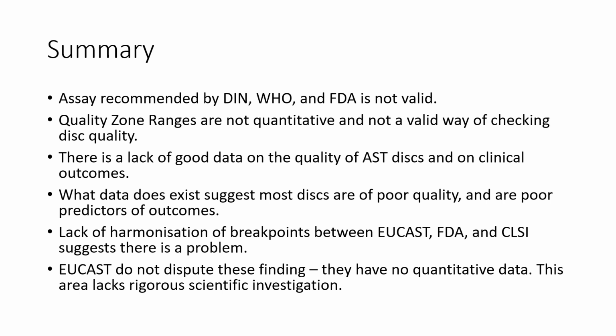If you look in the literature, there is very little that tells you what the true quality of the discs are, and the information that is there would suggest that many or most are out of spec. If you're looking at clinical outcomes, again, there is not much data, but it suggests that discs are not a good predictor of clinical outcomes.